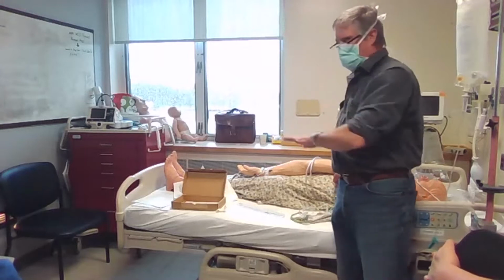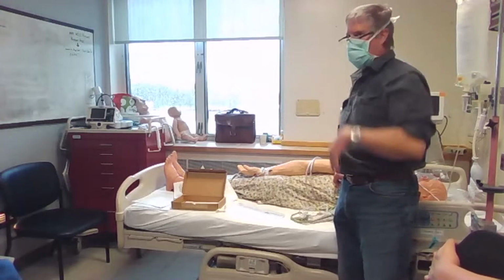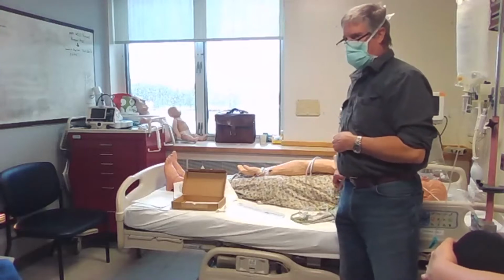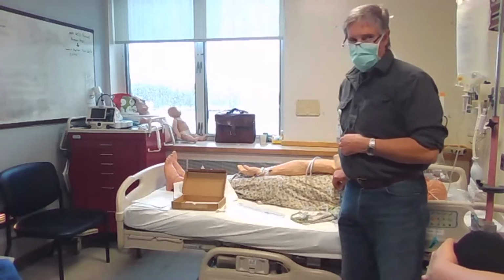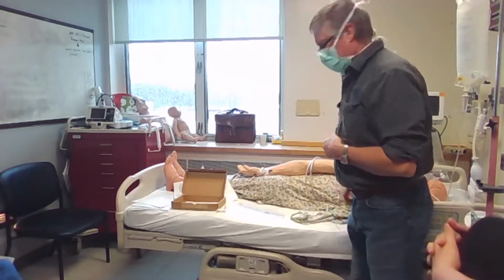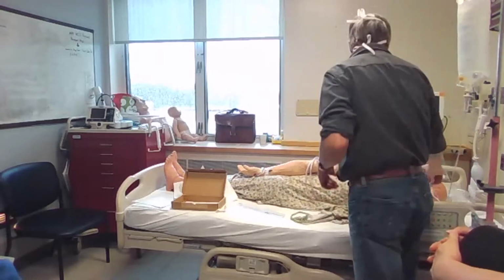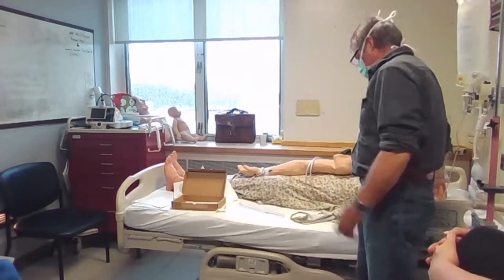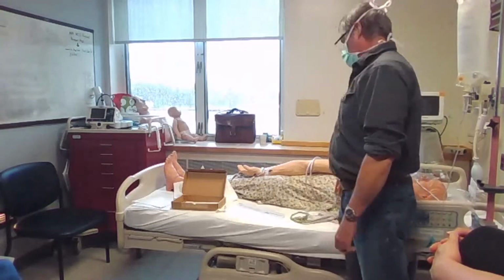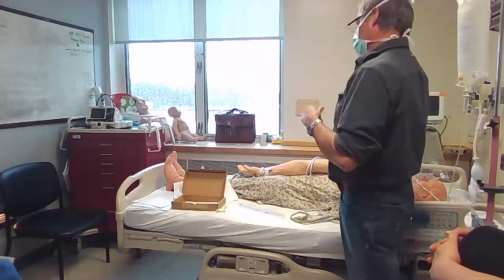The pressure that you got before you did this, no matter what it was, is not accurate. It could be really high, really low, whatever. Any questions about that? Kind of like zeroing a scale. Very, very important stuff. But that location is pretty standard. Yeah, that's pretty standard for any code or anything. When you're doing stuff with the brain, we put it at the earlobe, at the level of the auditory meatus, and then we're getting cerebral perfusion pressure.